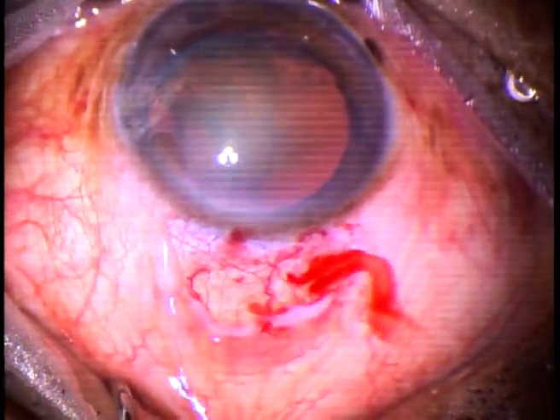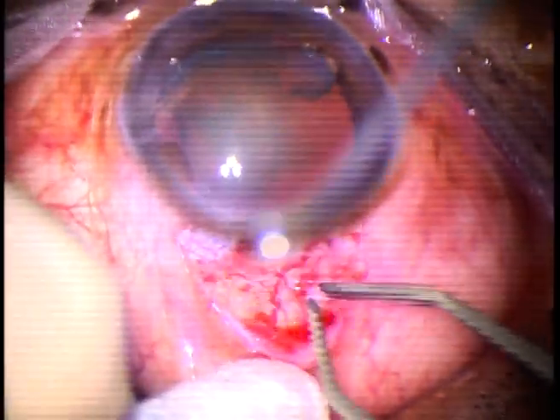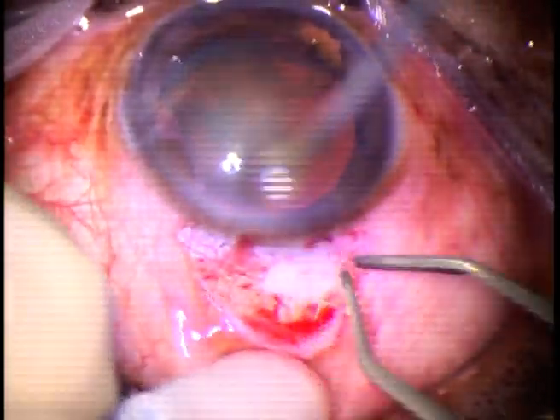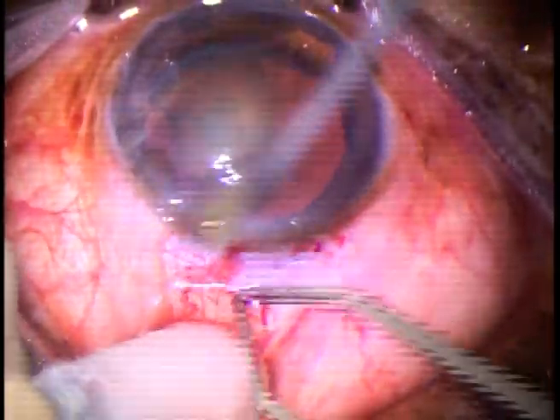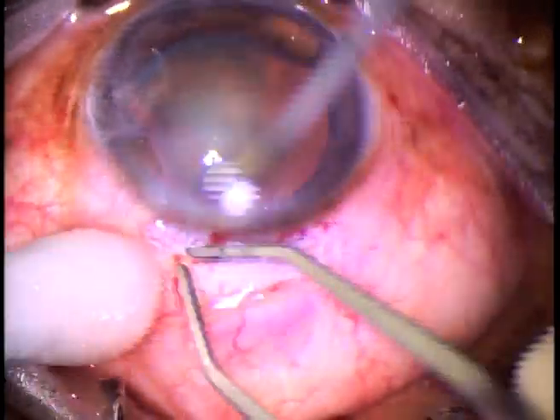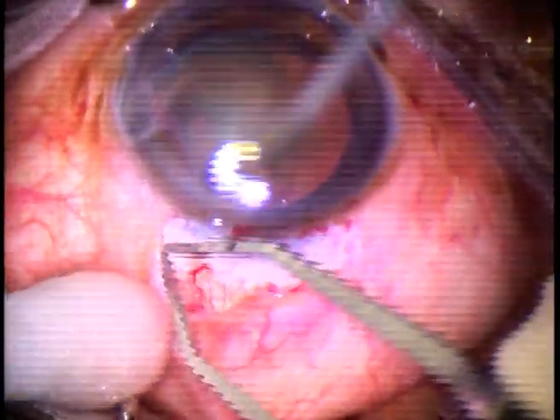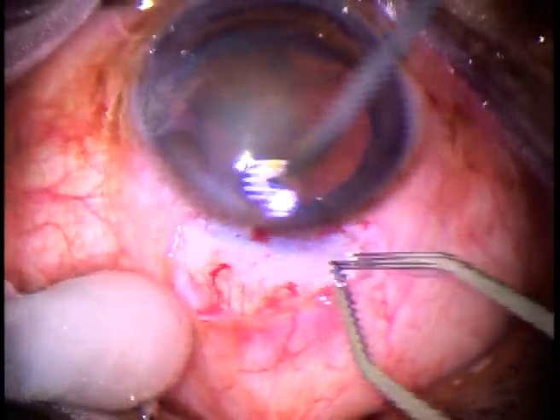Mild wet field cautery is done. Very minimal cautery is done — there should not be any contraction of sclera, and the blood vessel which is piercing the sclera and going inside the eye should not be destroyed.